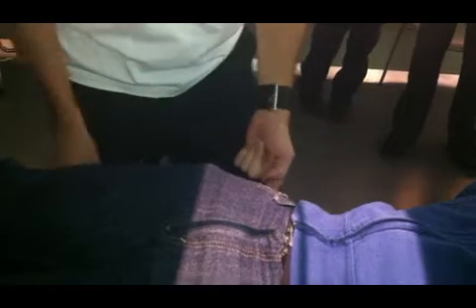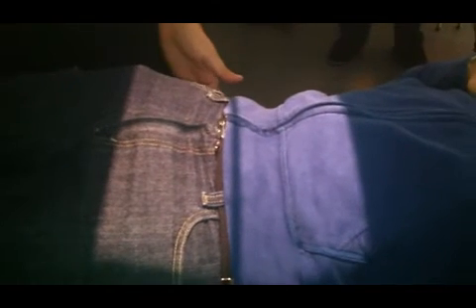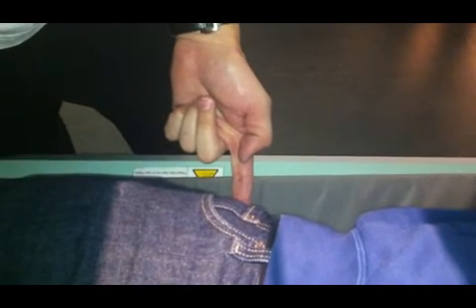What you can use is either the symphysis pubis here, or the greater trochanter. If you want to use the greater trochanter, all you have to do is put your finger along the outside and rotate the leg in and out until you find it. You can find it because it's a significant structure. It's going to flip around your finger going both ways when you abduct and adduct the foot towards the outside. That should correlate along the bottom of your symphysis, which is right about there for females.